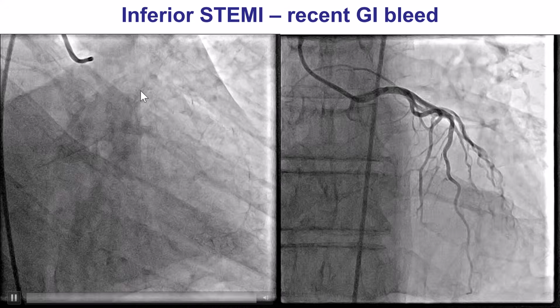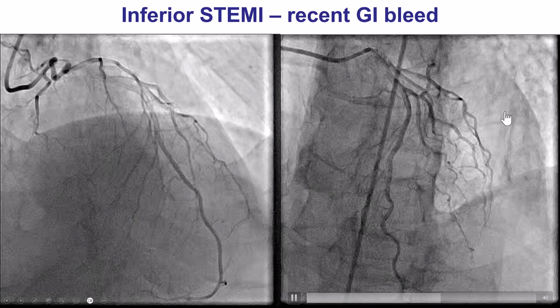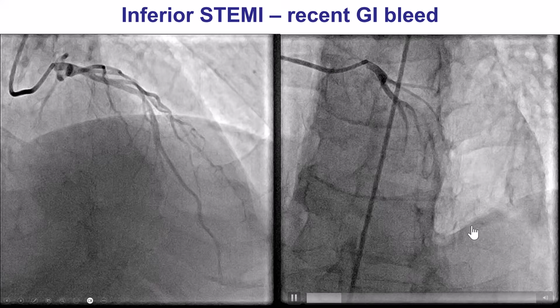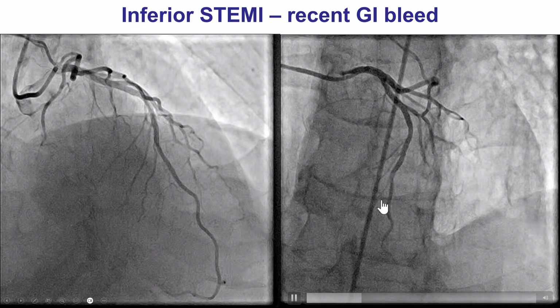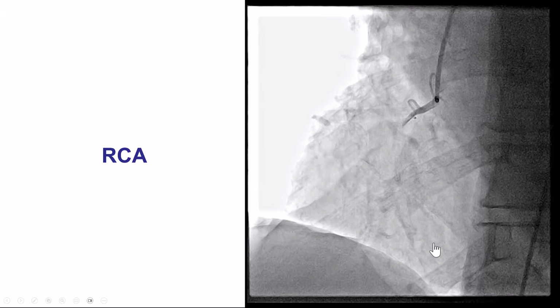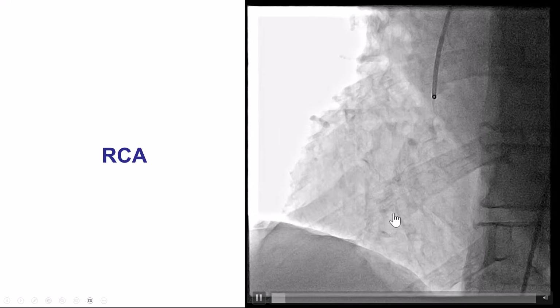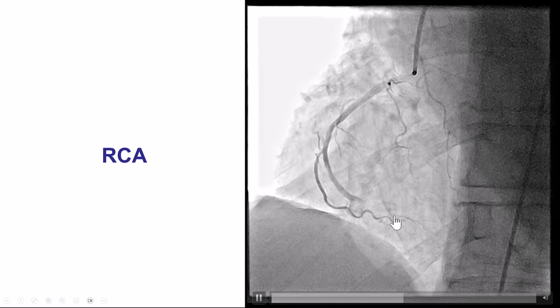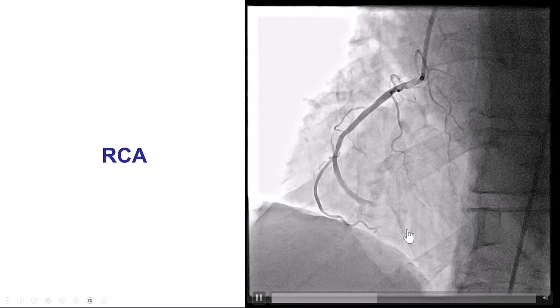Coronary angiography on the left side did not show any significant stenosis on multiple views. We did not see collaterals to the PDA or the posterolateral, which is sometimes seen in patients with STEMI. And this is the right coronary artery, and as expected, it is occluded distally. We can see some staining, which is probably thrombus retaining contrast at the end of the injection.